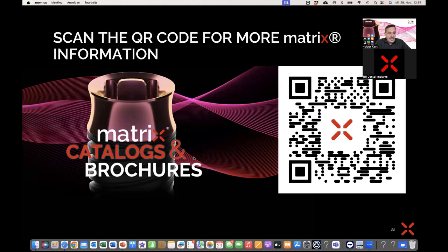There's printers which can only print more or less in the model area and are not accurate enough to print prosthetics. So one big point in choosing a printer at first is how accurately it can print. For example, it might be necessary to print with 50 microns to be accurate enough to screw retain a prosthetic directly into an implant. That should be really accurate printing, better than 50 microns. And if you start thinking about buying a printer, you have to also think about what type of materials can be printed with my printer. For example, again, with Sprintray, they have a large range of different materials to print, either for guides, prosthetics, or models, and this is really important.